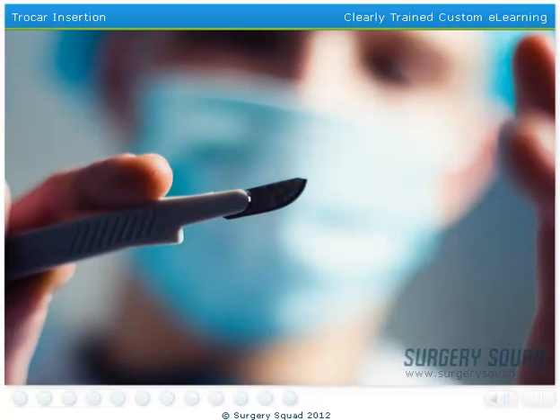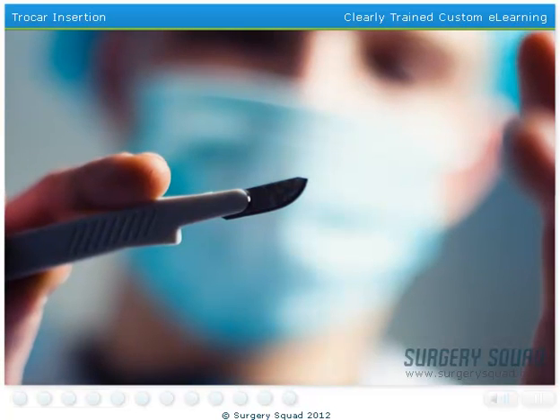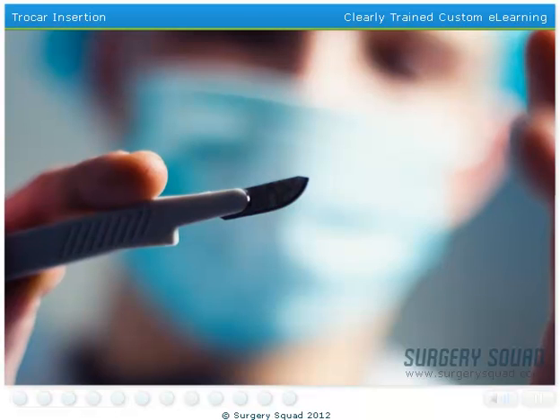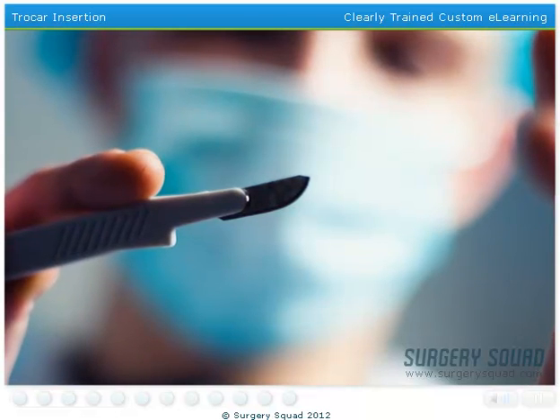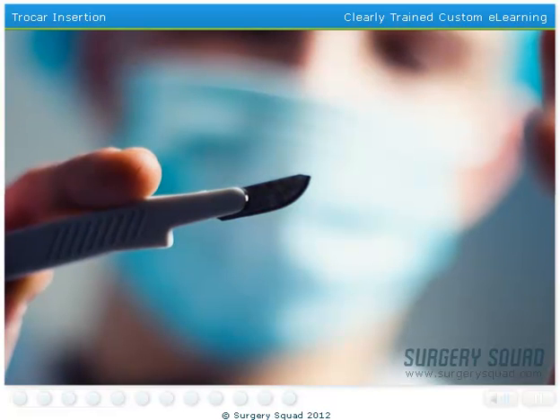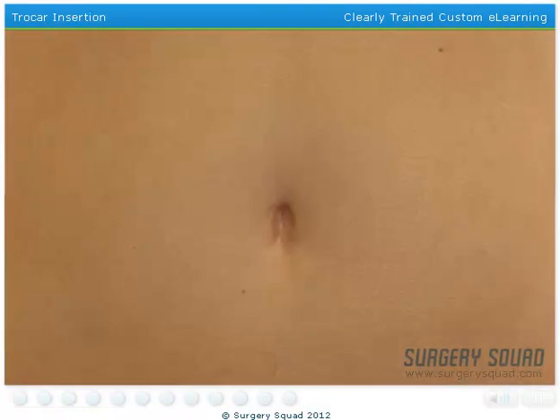Thanks to the advancements in medical technology, our patient doesn't have to be cut open to have her appendix removed. Instead, we'll strategically place special surgical instruments, called trocars, through small incisions in her abdomen to perform the surgery. We'll begin by making one small incision in her upper abdomen, one in her lower abdomen, and one in her navel, also known as the belly button.